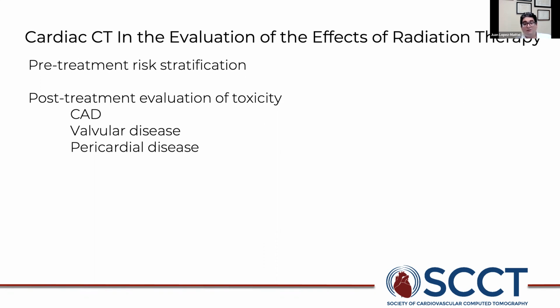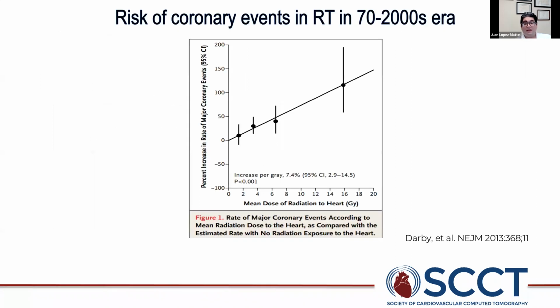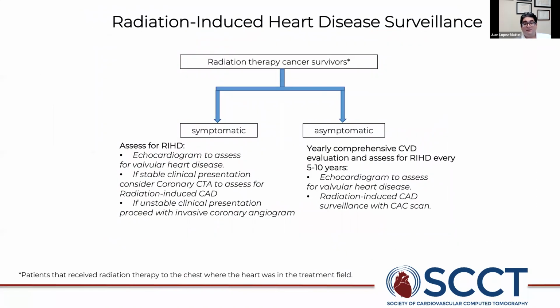The strength of the surveillance part is that when you're monitoring the patient, you could do calcium scores, and if there's no known history of ASCVD, you could identify at some point if there's development of calcification, to treat promptly and do the appropriate preventive care.